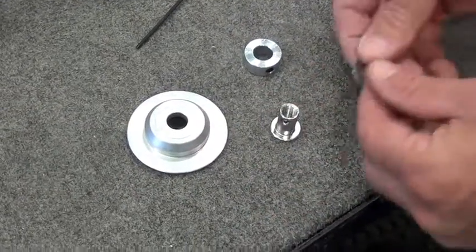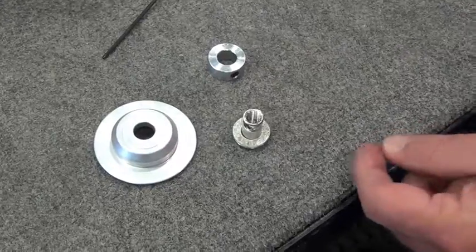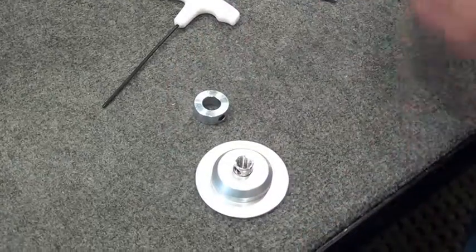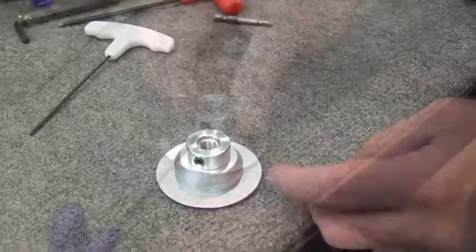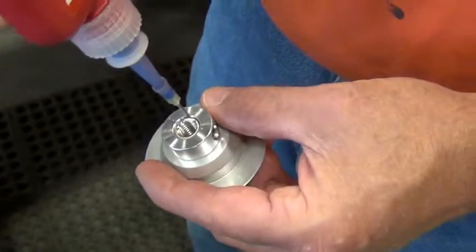A 1/2 inch race, needle thrust bearing, and a second race slide into the junction nut. The bearing adapter plate is placed over the junction nut and then the locking collar. The set screw is aligned with the hole in the junction nut and threaded in just enough to engage the hole. Blue Loctite is applied.